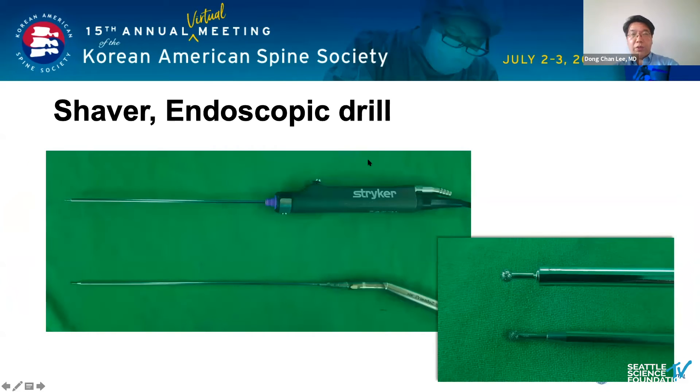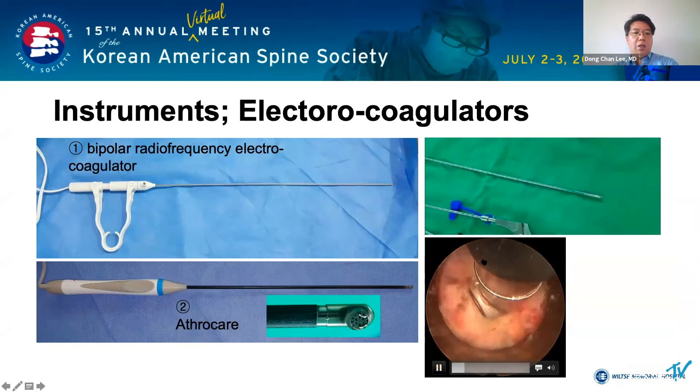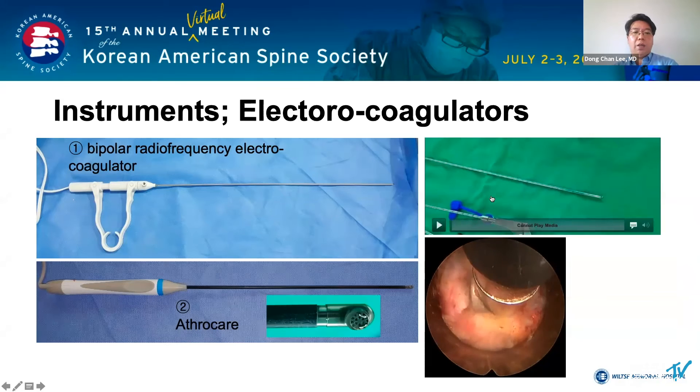To perform the decompression of the bone, you can use a shaver or a variety of endoscopic drills. You can use AstroCare and Elman to dissect soft tissue and control bleeding. When you grasp Elman's handle, the tip is bent upward.